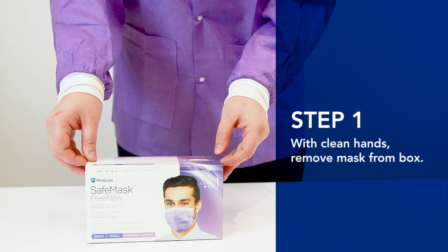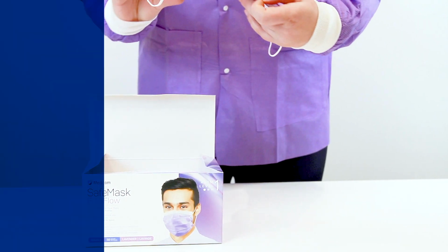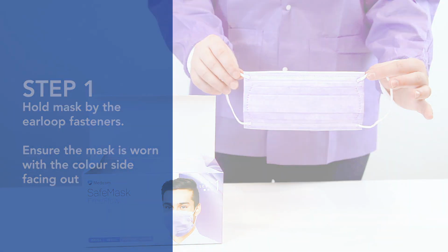Step 1. With clean hands, remove a mask from the box. Hold the mask by the ear loop fasteners. Ensure that the mask is worn with the color side facing out.